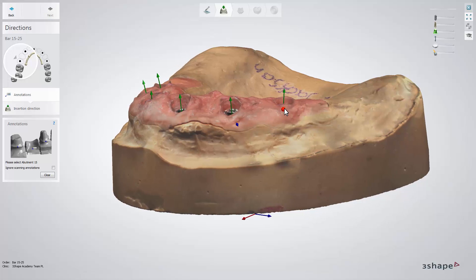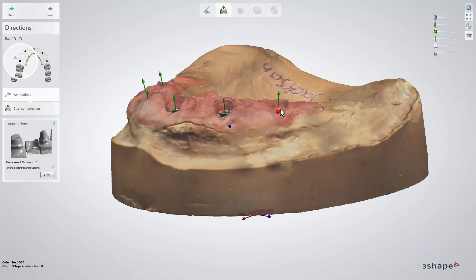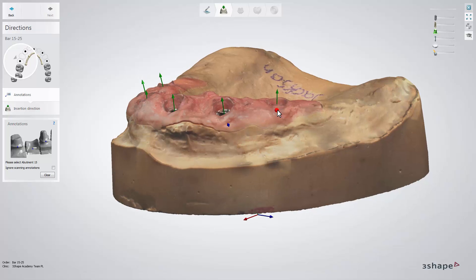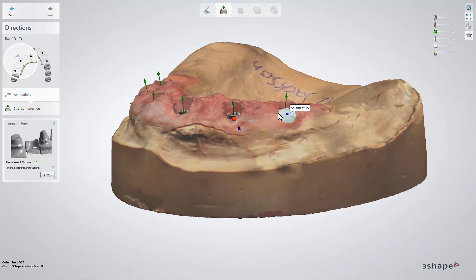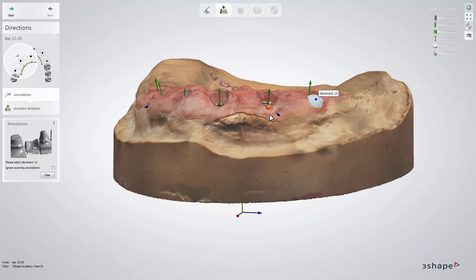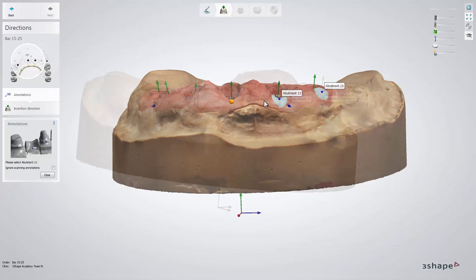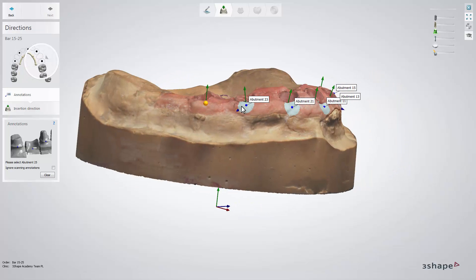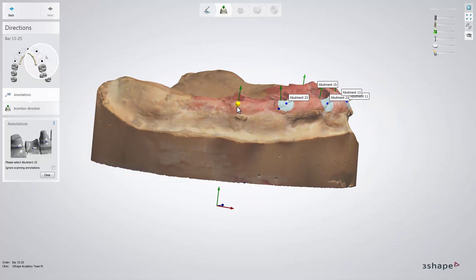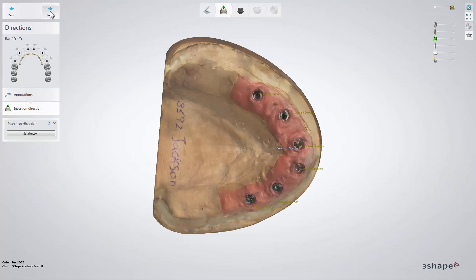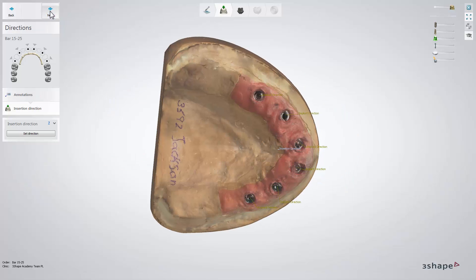Once your model has been scanned, place the annotations keeping in mind that they should always be placed on the buccal side of the gum near the margin. Then click next to move to the insertion direction step.